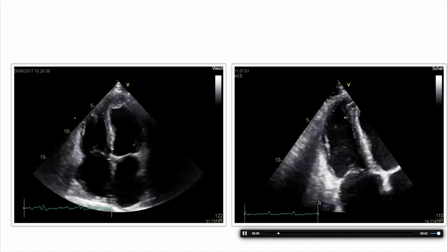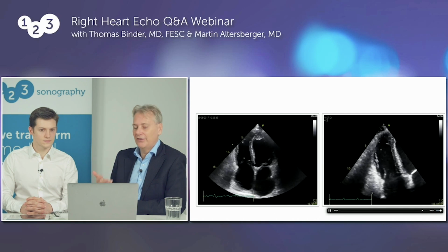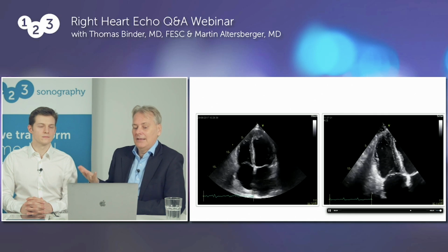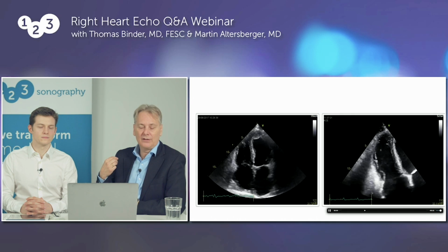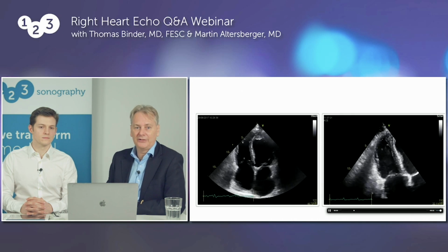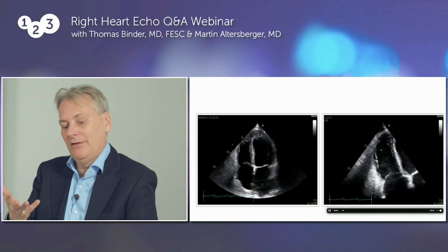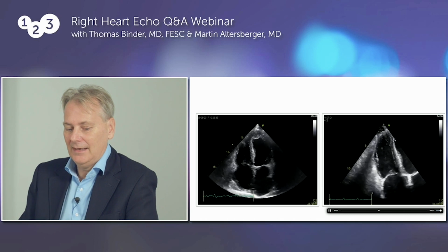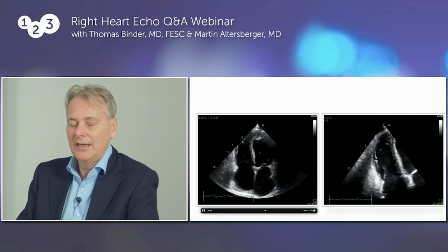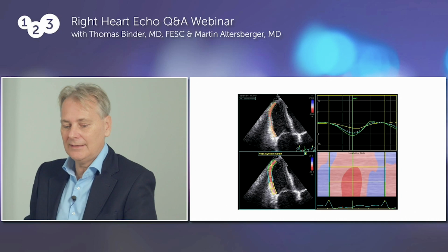If you have a patient after transplantation who has very, very poor left and right ventricle function, this could be many things. One of the most common things you have to think about is that the patient has some form of transplant rejection. In this case, that would be my most likely guess. Obviously, the thrombus is also related to the poor left ventricular function, but not always. I'll come to the conclusion of this case later, but let's take a look at the strain.